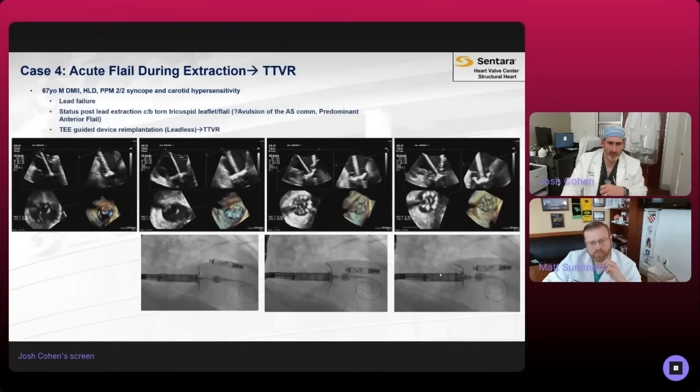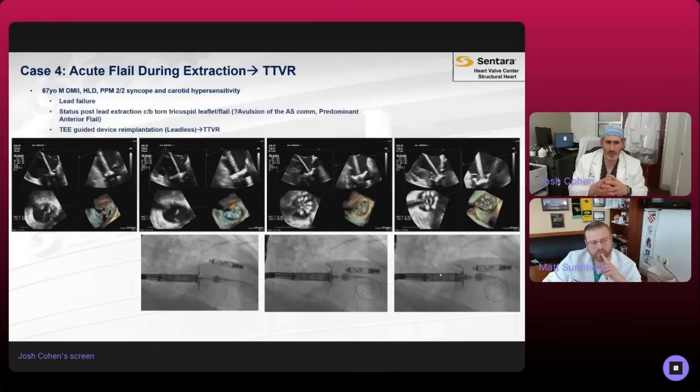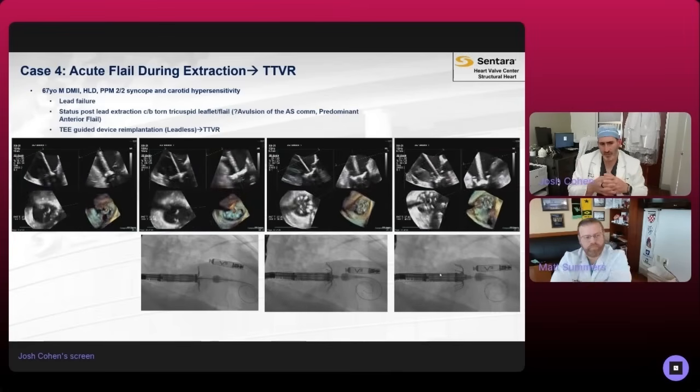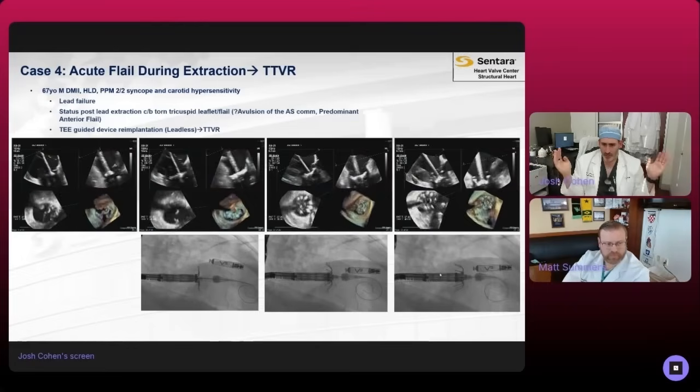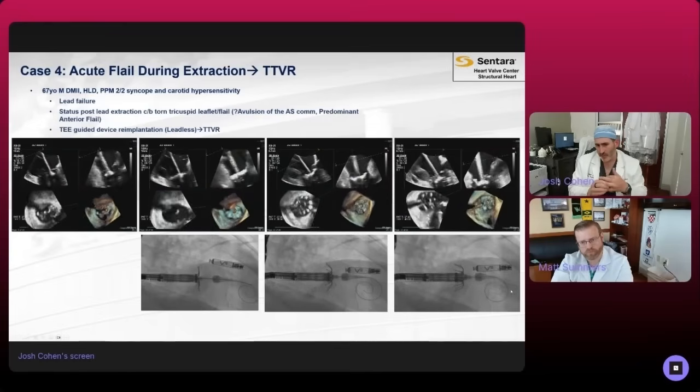So then, really, and sorry, these are a little out of order, but really what this ends up being is you start to slowly deploy the arms of this device, and then they start to curl up. And basically about halfway through that, what you're doing is you're making sure that you're in position to capture all these leaflets. And so this is a pretty imaging-intense procedure.